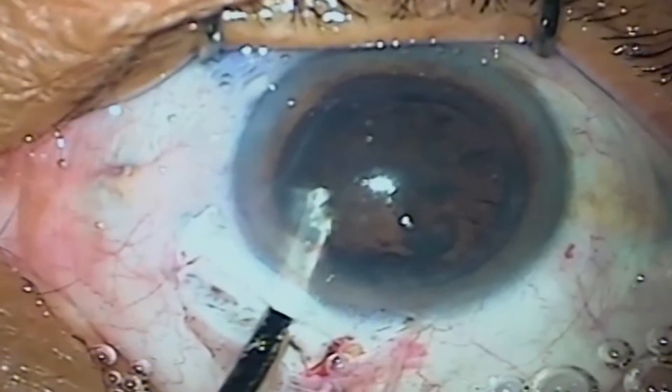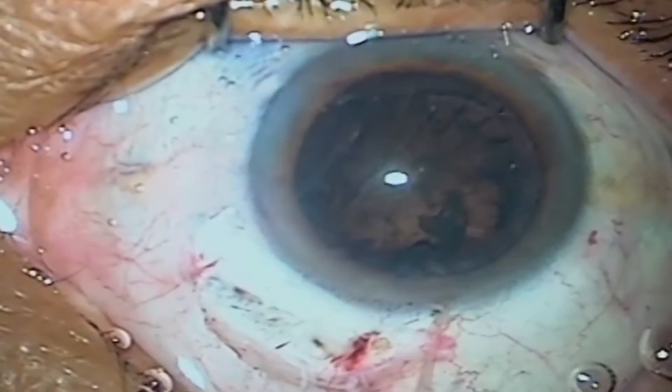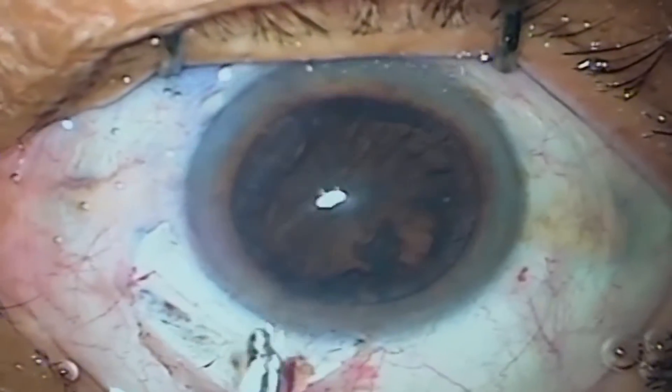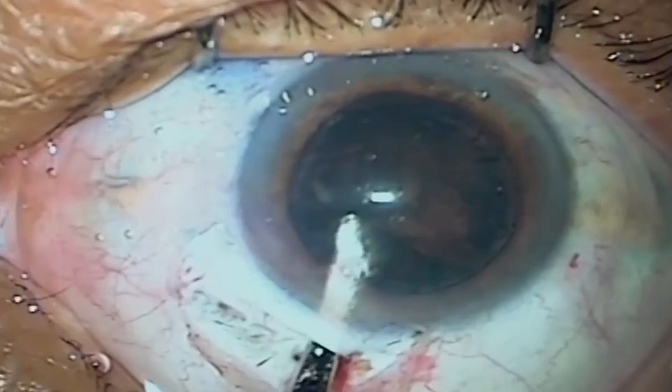In this case the pre-existing corneal astigmatism was 1.25 diopters. Day one acceptance was plus 0.50 diopters at 50 degrees. Final vision at one week was unaided 6/6 with acceptance of plus 0.25 cylinder. Enjoy the video.